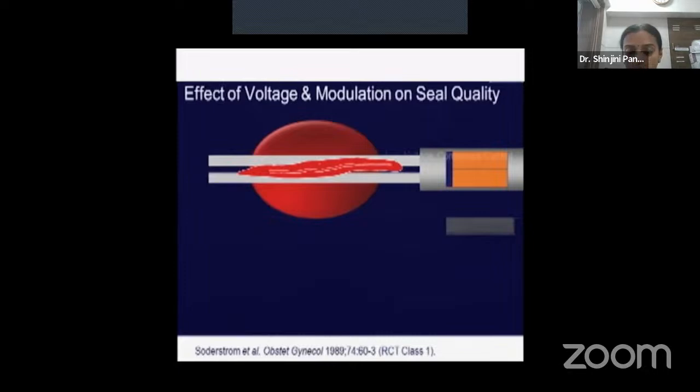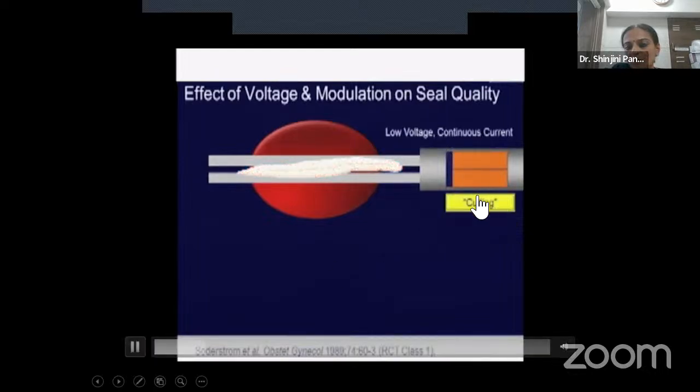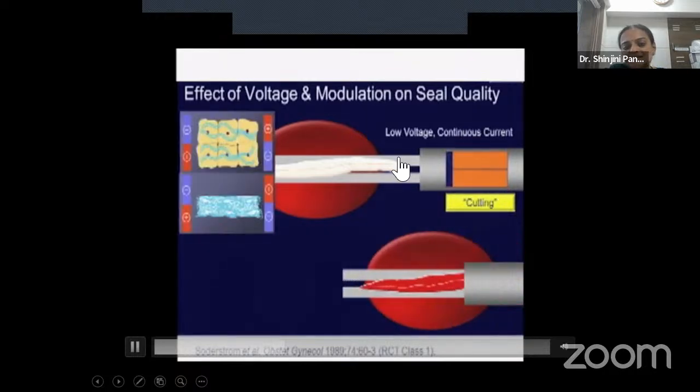If you press the yellow, you are actually sending in low voltage and continuous current, and the coagulum that creates in the vessel wall is uniform. It is like slow heating of the toast on the tawa. If you heat the toast on a slow flame, the whole toast becomes crisp. However, if you heat the toast on a very high flame, the surface of the roti or the bread becomes blackish, but when you bite inside, the inner core is soft. Similarly, here the surgeon is using the yellow pedal and is sending low energy, low voltage, but for the full duty cycle, and this is the white seal that develops.